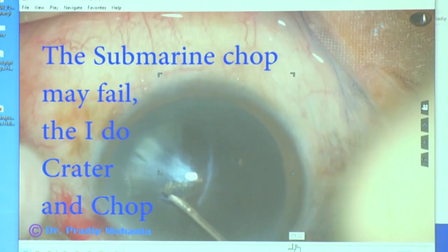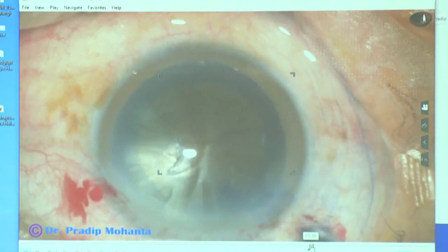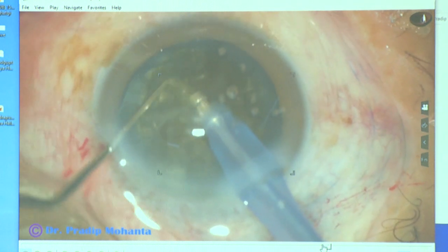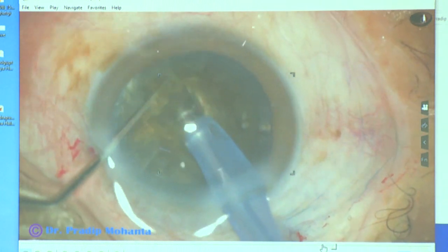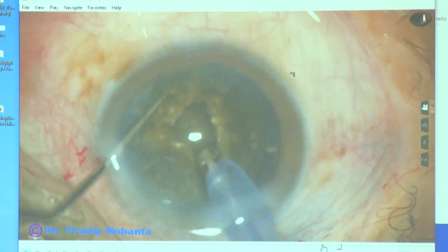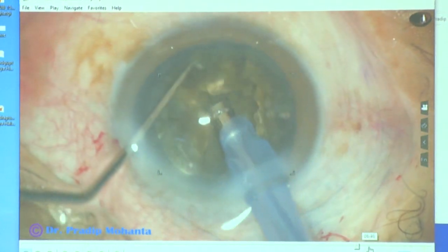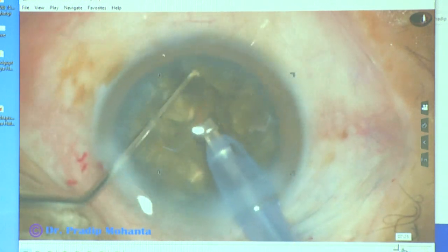In this case, the submarine chop failed. After rhexis and hydrodissection, go with the phaco handpiece, and here you see that I cannot get a good hold. I needed to go to a much deeper plane, but this didn't happen in this case. So when the submarine chop fails, I make a deep crater at the center, almost 80% deep. And then I start dividing the nucleus into parts and emulsify the pieces. Rest of the case is as in other routine hard cataracts.